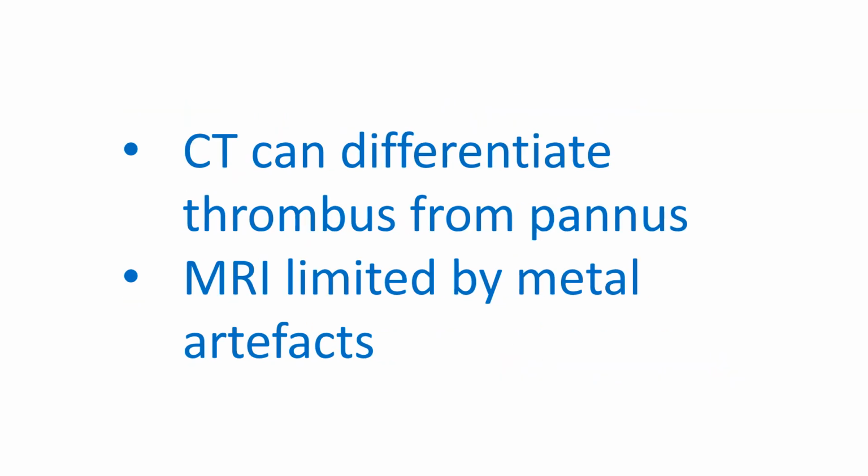Computed tomography may complement echocardiography by differentiating between thrombus and pannus as the cause of obstruction. Calcification of bioprosthetic valves can be documented better with CT. MRI can show abnormal asymmetrical flow patterns in prosthetic valve obstruction, but presence of metal artifacts limit direct evaluation of prosthetic valve structure.